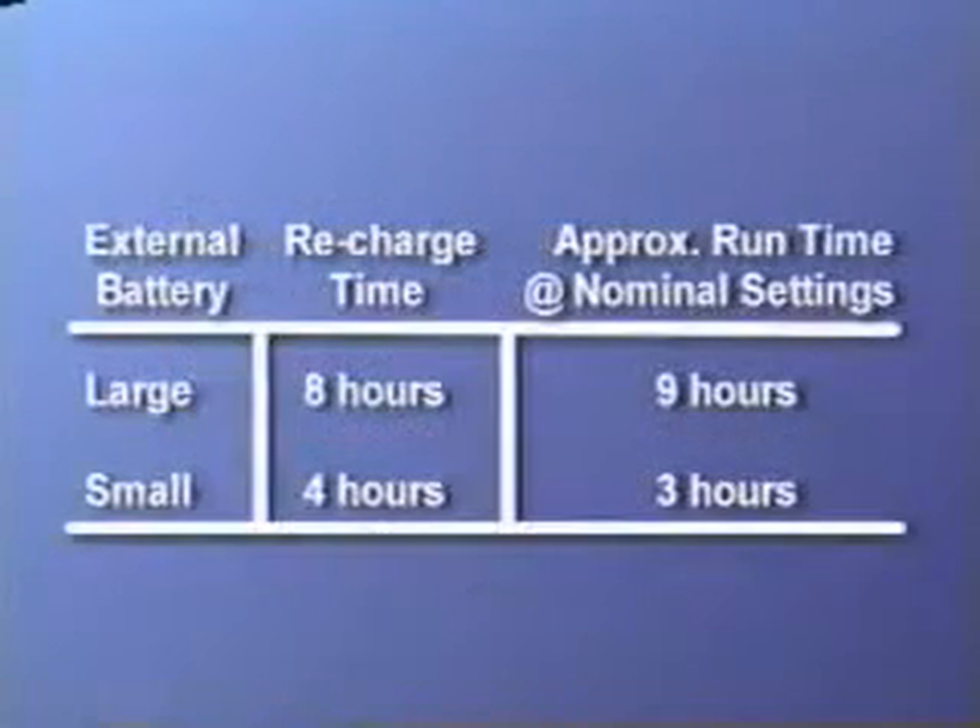The large external battery pack can be fully recharged in 8 hours and will power the ventilator for approximately 9 hours on a full charge. The small external battery pack can be fully recharged in 4 hours and will power the ventilator for approximately 3 hours on a full charge.